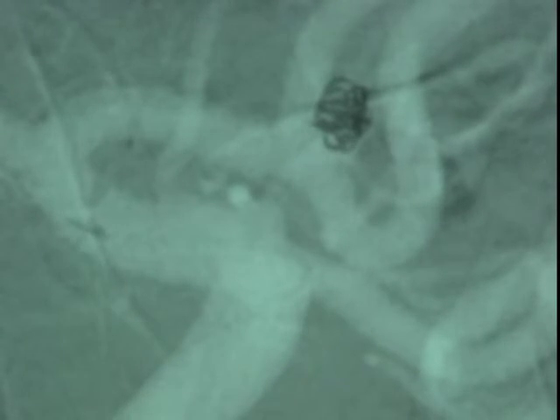This coil did not completely release, and it is being released again.